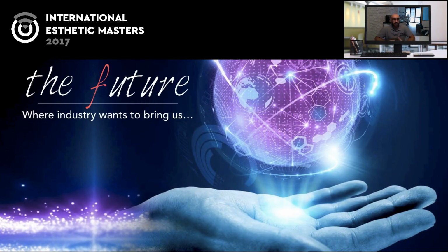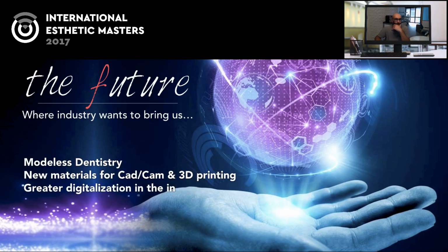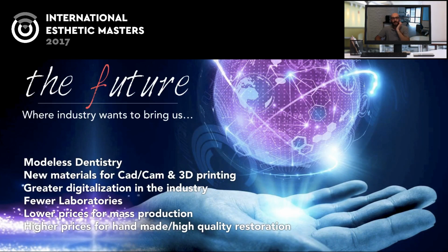So what will happen in the future, where does the industry want to bring us? This is just my opinion. It's funny, they always want to go toward this model-less dentistry. New materials are coming for CAD/CAM and 3D printing, but we have to be careful with these new materials. My suggestion is to wait a little bit. We have today a lot of materials that you can choose for your restoration. Don't always go looking for something new. It's important to know the material that you use in the lab, and you maybe need a few years to understand how this material works. So be careful with new materials.